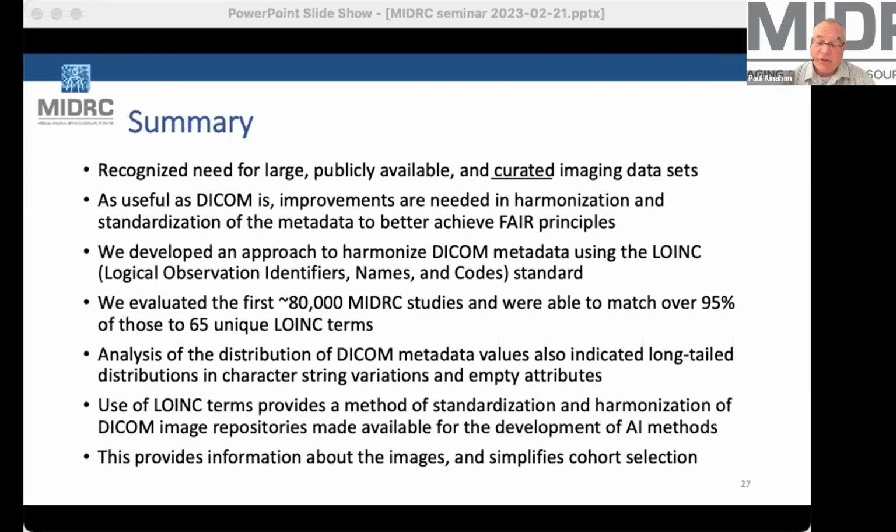Part of it is, I think, due to the fact that, which I didn't talk about much, the images are de-identified before they leave the site, and there's a couple of recommended processes by the ACR and the RSNA, but the sites will do what they can, and we're grateful for the images that we do get, but there have been times where literally everything in the DICOM header has been wiped out. We even have to guess at the modality in some cases. So for some of those, there is a code called unspecified body region, so we can use that.